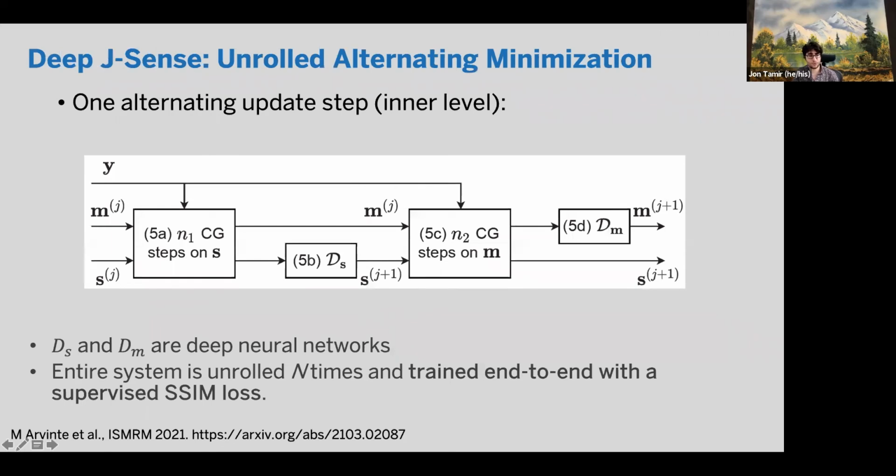One thing that's really important to note is that this network here needs to be agnostic to the order of the sensitivities, right? If I permute the data, there's no order to which coil is coil number 1 and which coil is coil number 2. And so I don't want my network to memorize the ordering of the data. And in particular, I also don't want it to memorize the shading of the maps, right?